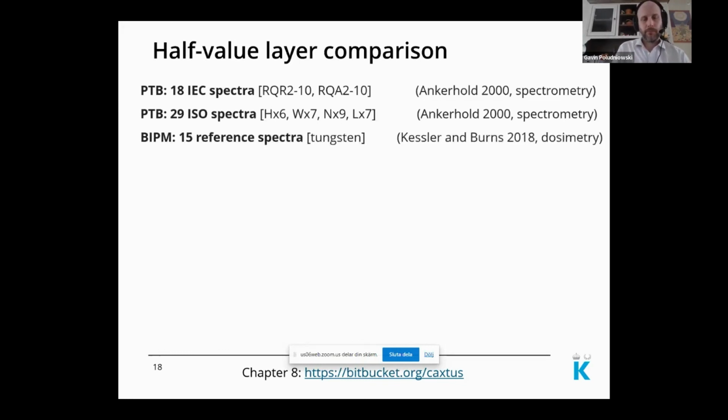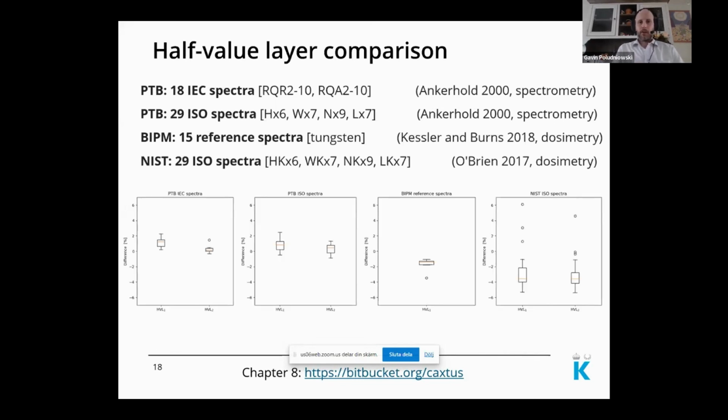And then I have 15 reference spectra from BIPM, and the same 29 ISO spectra as for the Ankerhold report, but as according to the NIST beams.